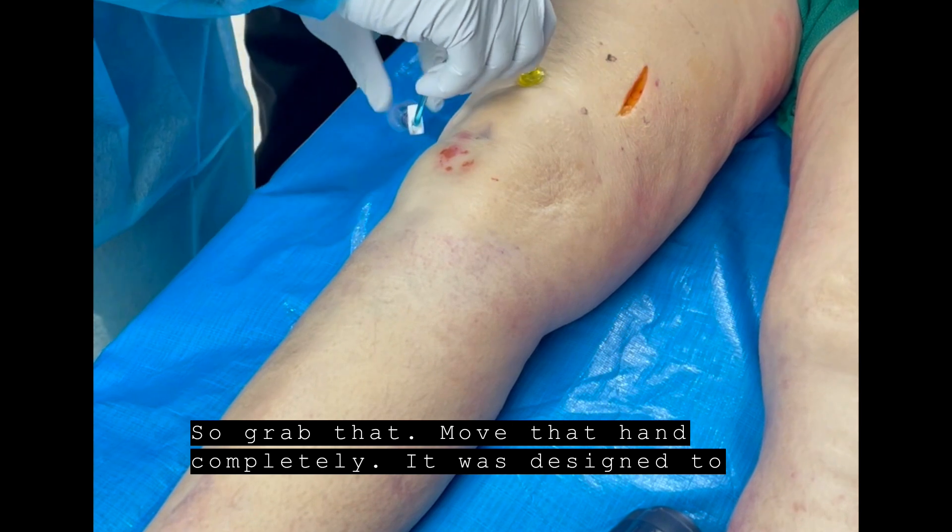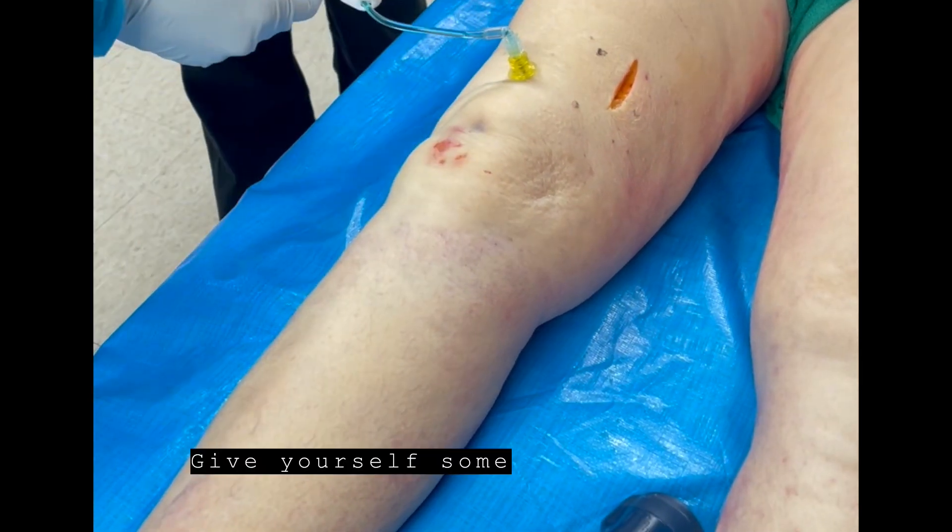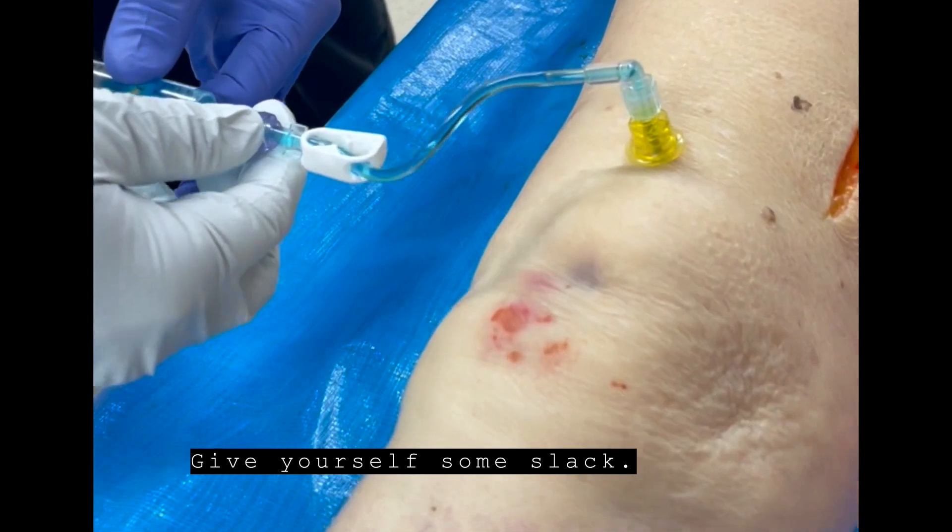Don't move that hand completely. Remember, it was designed to be applied with one hand. Give yourself some slack. Go ahead and aspirate.